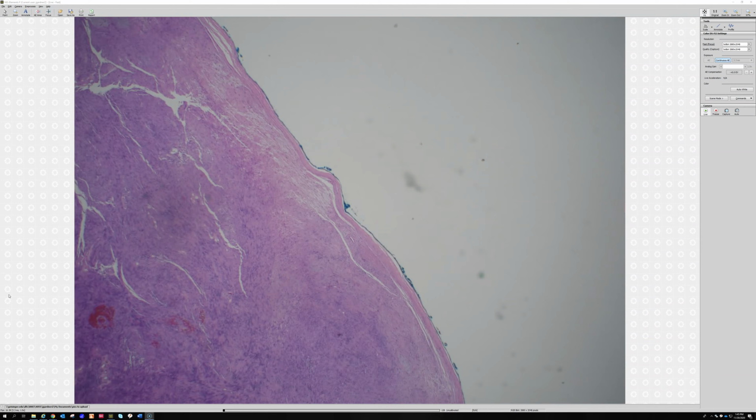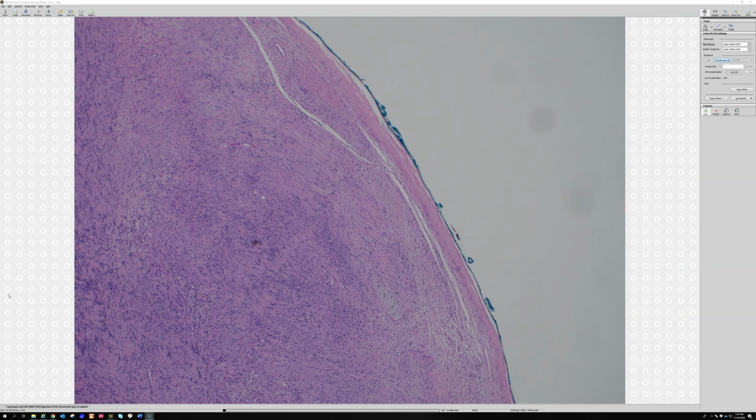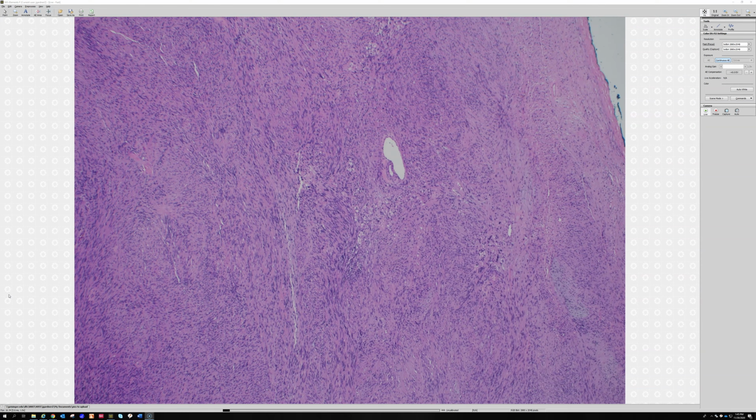a thick fibrous capsule. And that's because schwannomas arise out of the nerve and they grow and push outward from the nerve. And so what happens is the perineurium gets pushed along with it and it gets kind of fibrotic and sclerotic around the edge. But a lot of times if you do a perineurial marker like EMA or GLUT1 or Claudin-1, you don't have to do this. But if you happen to do one on a schwannoma, you'll see a layer of perineurial cells in this outer capsule oftentimes, which is kind of evidence that it's arising from within a nerve and pushing it out. And of course schwannomas are made of Schwann cells, so they're going to be diffusely strongly positive for S100 protein and SOX10.